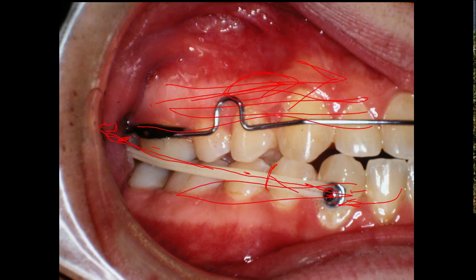If you can take a retainer and put it in somebody's mouth and hold their teeth in place, put a bite plate on them so these teeth fit right up there, if that's fitting right, then you come in with this 4-to-4 retainer. Actually, it's just a 3-to-3 extended to the bicuspid. And it has to be a solid bar. I mean, something at least, this is an old 28 bar in here. This is an 036 back in the back. And they're soldered together right in here. See? And I think this bar on the bottom is probably an old 28 bar down there.